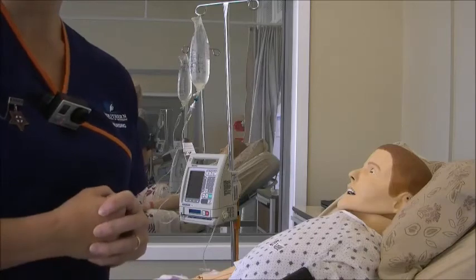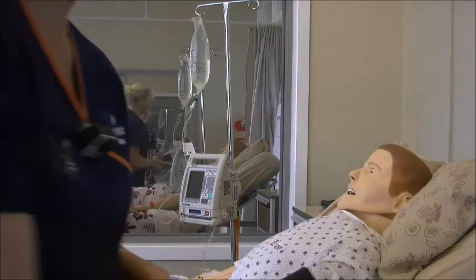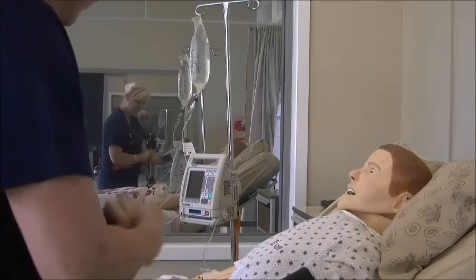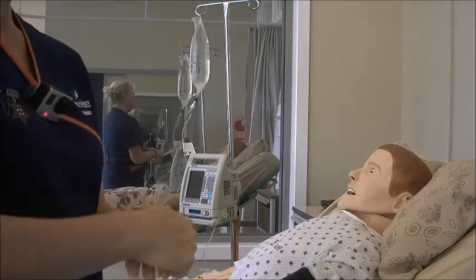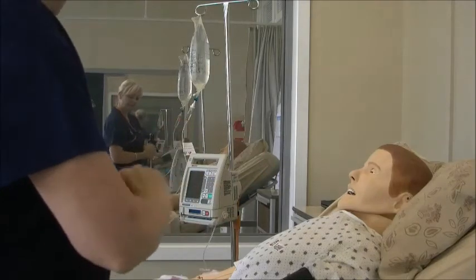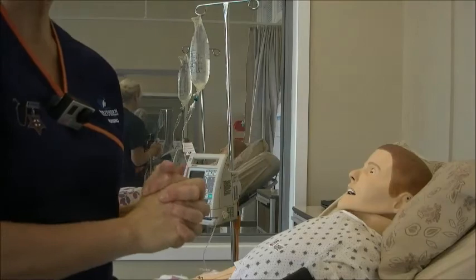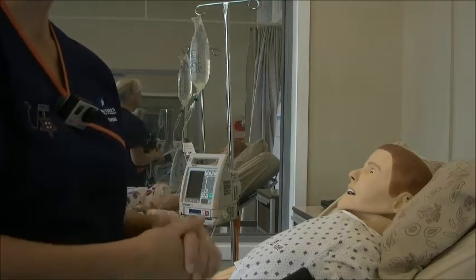I'm then going to come back and assess how my patient's going. So I'm coming back into the room, I'm going to use the hand rub, because there are still a couple of assessments that I need to do. So my IV is running at the moment, so I'm quite happy with that. And I've been asked to do a cardiovascular assessment and a neurovascular assessment. So I'm going to start with the neurovascular assessment first.